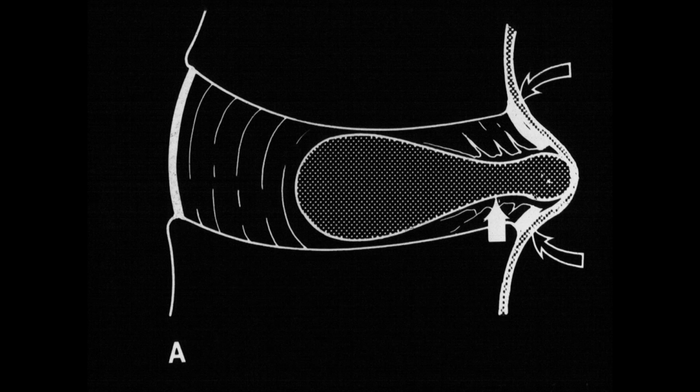That really has meaning if you do a discogram, which hopefully we're not doing anymore. By MR, we can't really see this, so I don't think it's an important criterion for MR.